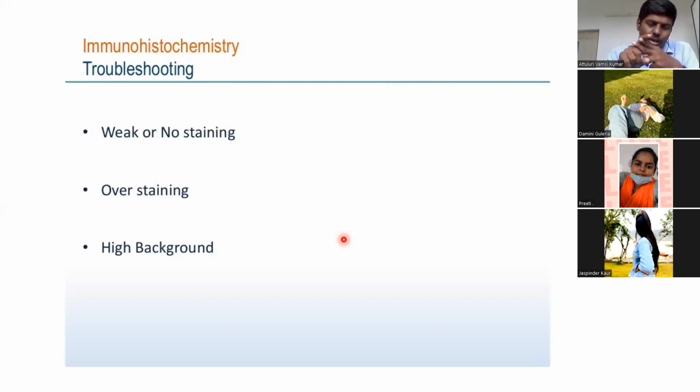Then overstaining. I may get overstaining due to our inability in blocking endogenous enzymes. Maybe the tissue's endogenous enzymes have not been properly blocked.